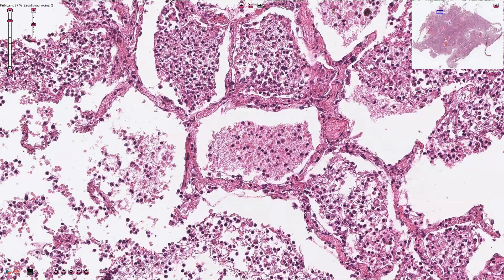This tissue is lung parenchyma. Here we have alveoli with inter-alveolar septi, and the inner surface of the alveoli is lined by pneumocytes.